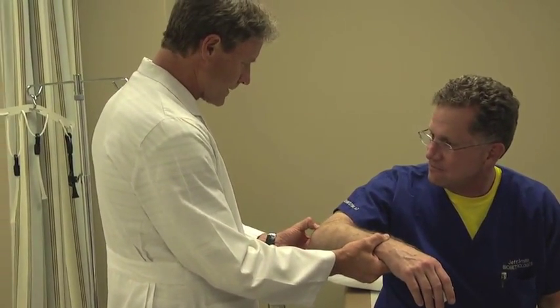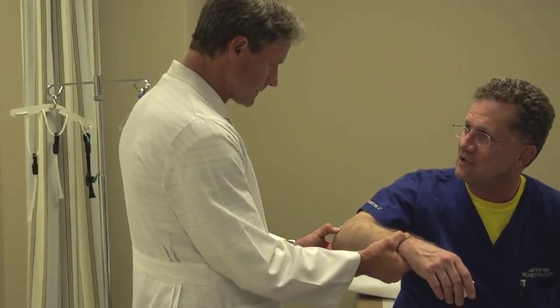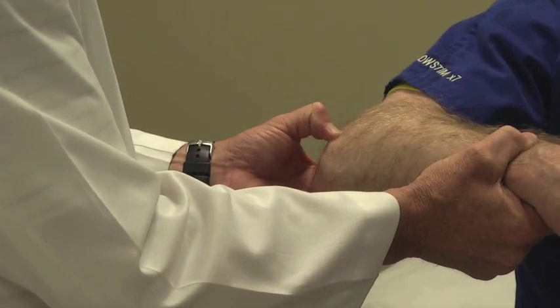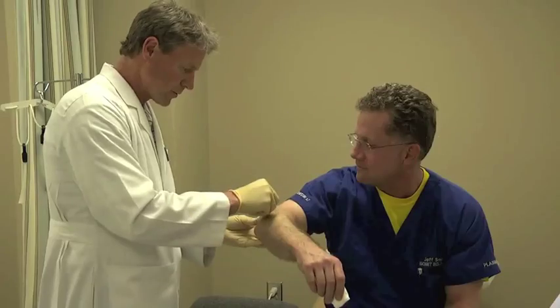Next, we'll identify the injection site on the patient. Here we're looking for the most sore area in the tendon region of the lateral aspect of the elbow. Basically, this is an injection for tennis elbow or lateral epicondylitis.